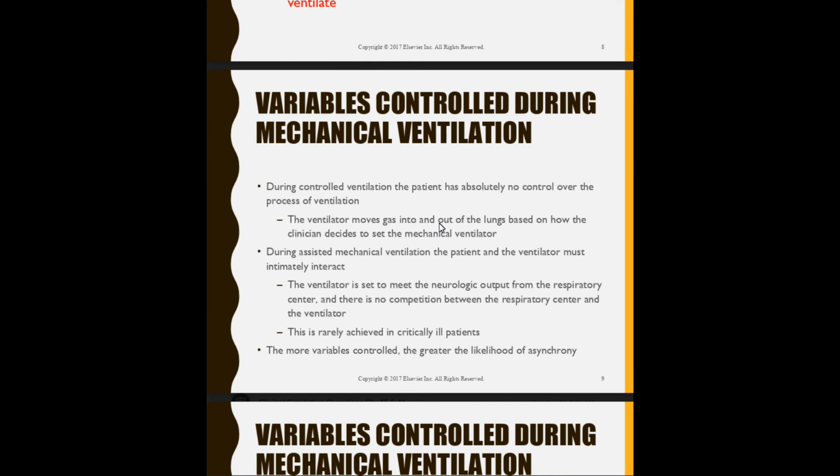Now, that is where we allow them to take over, and their neurological outputs are on point. So SIMV would be a good mode for them to start breathing on their own, to start increasing their muscle activity, because most likely if the nurses were able to kill off the bacteria, let's say that was causing pneumonia, their static compliance starts to increase, and airway resistance starts to decrease because we pretty much killed the bacteria. So we're clearing out the airway, and the patient's feeling better.